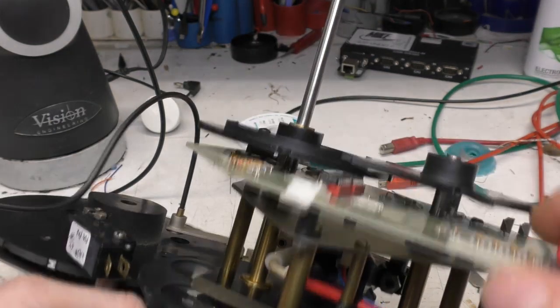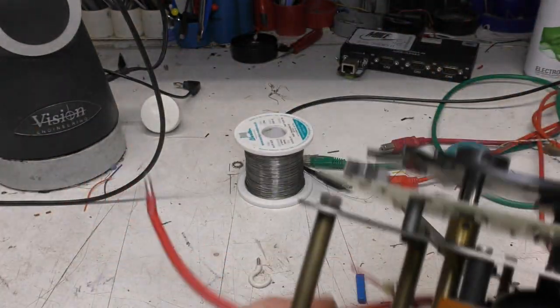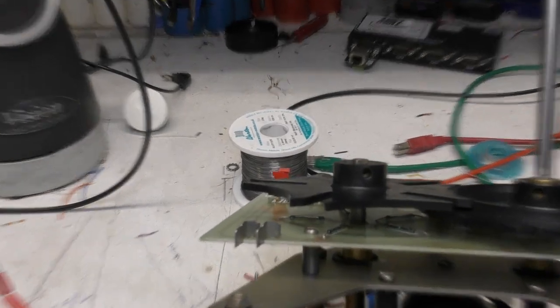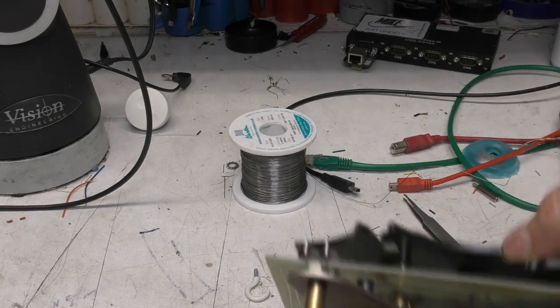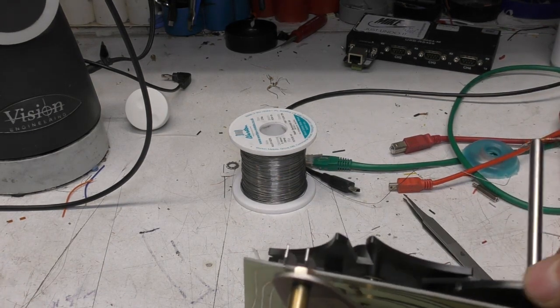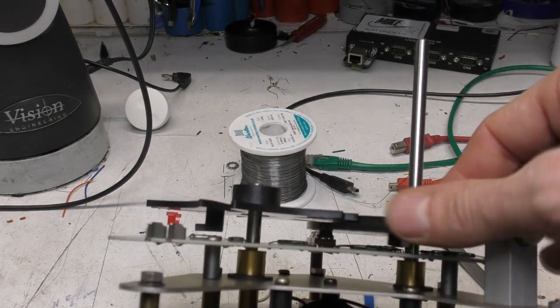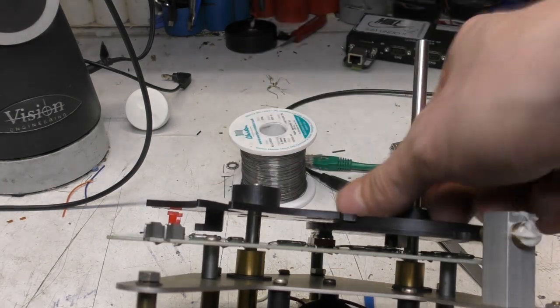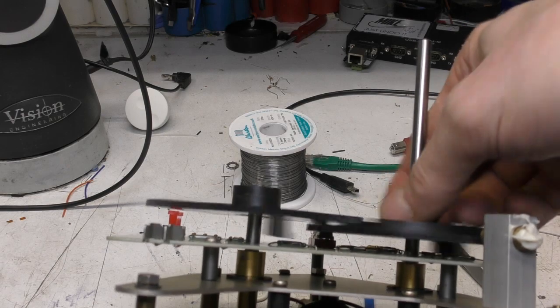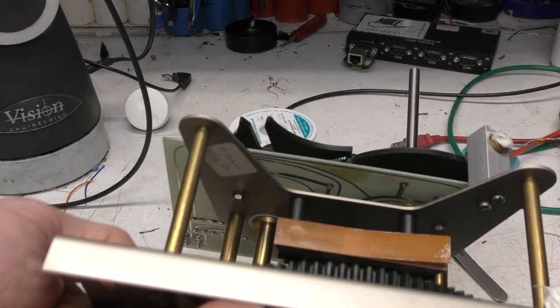And for the display on the front, this was the one that was indicated by the 7-segment display. What they've got is an array of reed switches on the PCB, which are operated by two magnets on the wheel. So there's a magnet on this wheel here, and this one there you can see there. And they just operate whichever reed switch is closest.